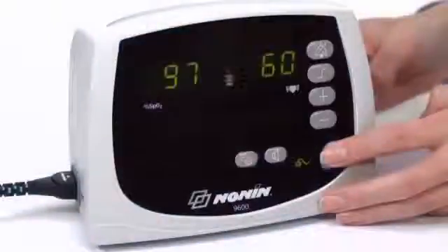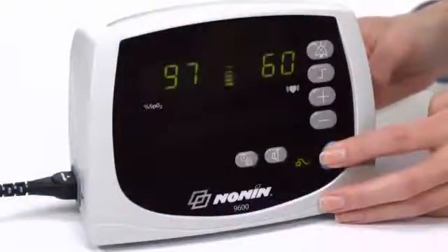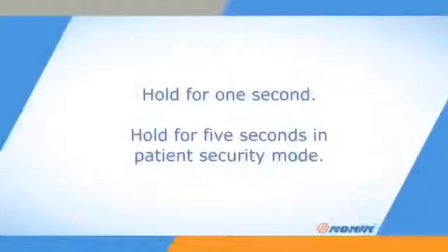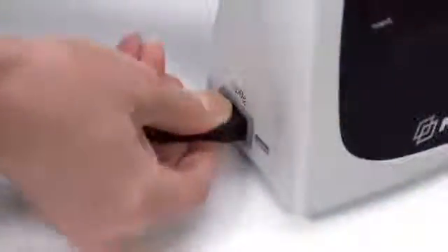When you are ready to stop using the oximeter, simply press and hold the on-off button until the unit turns off. Hold for 1 second in normal function and 5 seconds if the unit is in patient security mode. Then remove the sensor and unplug it from the oximeter.